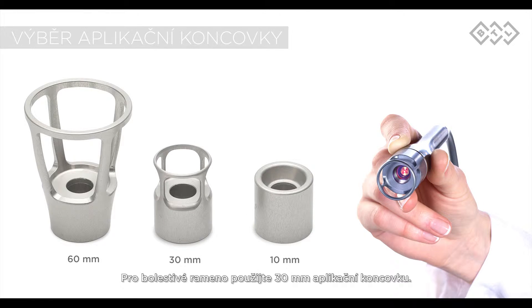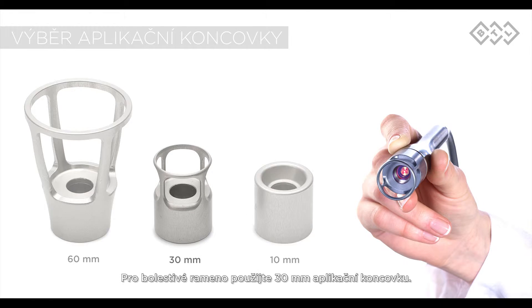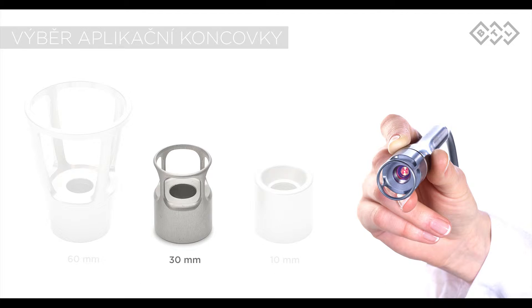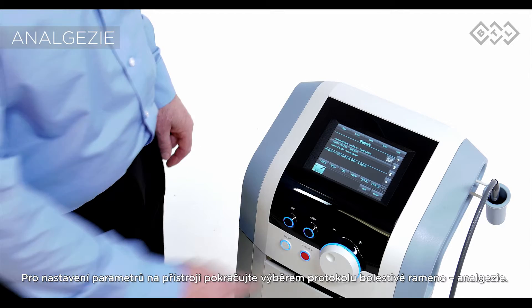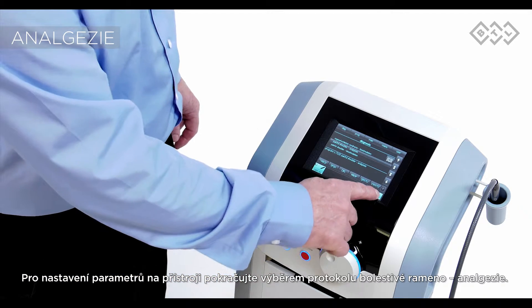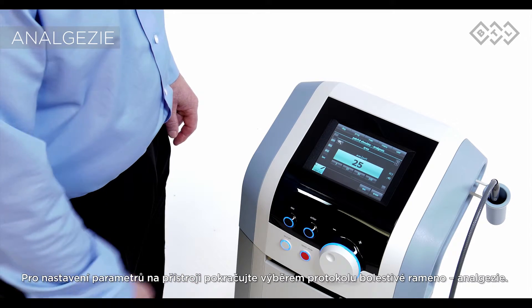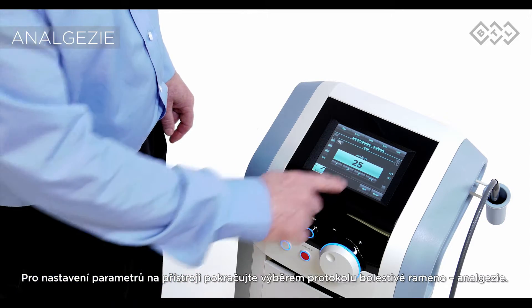For a painful shoulder, select the 30mm spacer. Continue by selecting the painful shoulder analgesia protocol to set the parameters on the device.